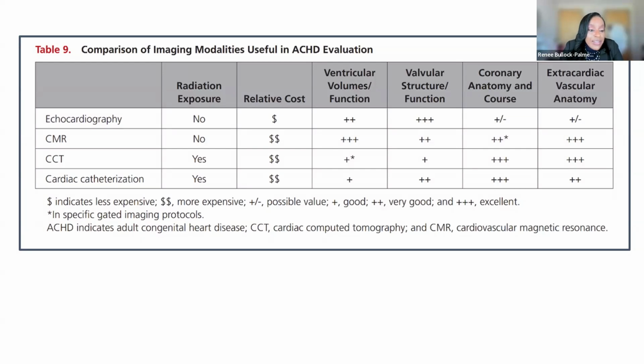And of course, there's invasive testing with cardiac catheterizations. There are times where the patient may not be doing very well, and you really want to measure your QP-QS ratio. You want to look at other things, and may even have to make some decisions about treating these patients, especially if you can put a stent in a Fontan that's thrombosed. There are times when you definitely need to send these patients for an invasive cardiac catheterization.